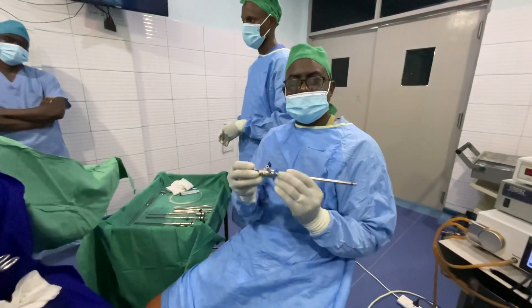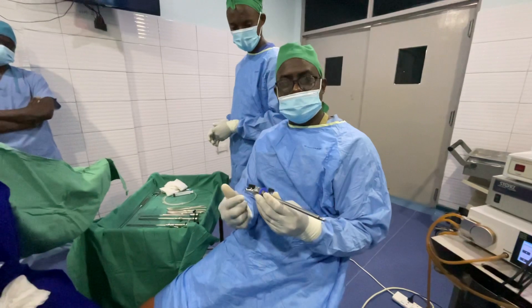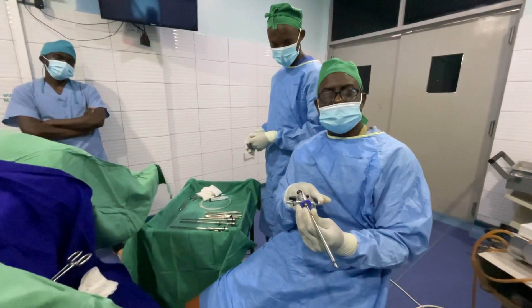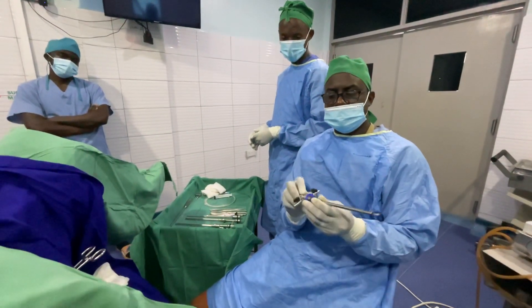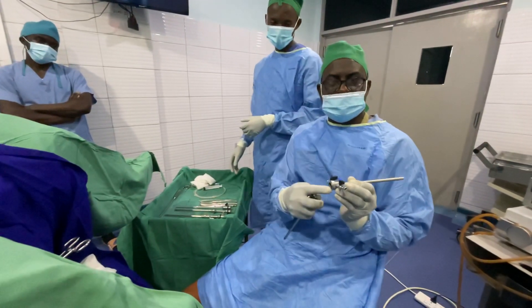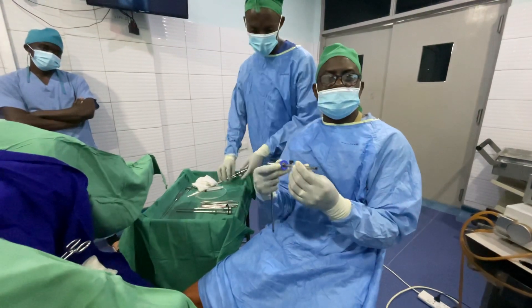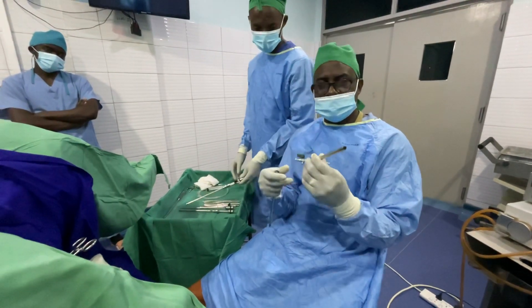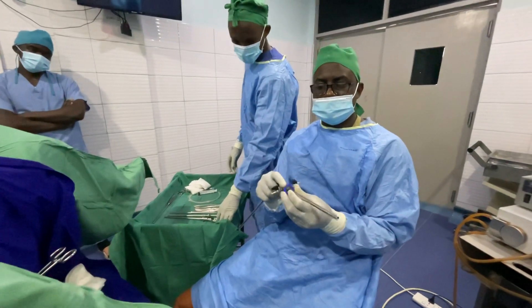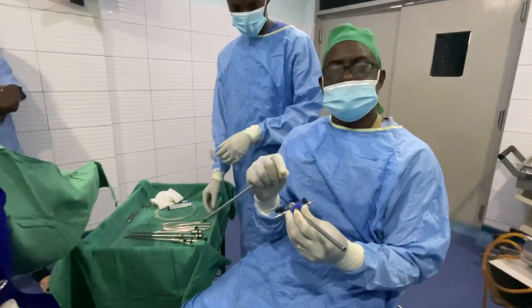This is the operating channel. It has ports for fluid in, fluid out, and then a port for the telescope. The telescope goes here. This channel is about 8 millimeters, so if you need any operative intervention you need to dilate the cervix to around 9 millimeters.